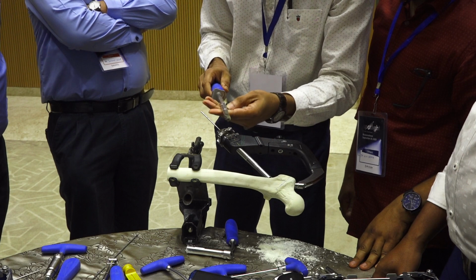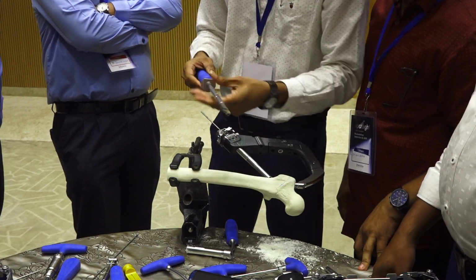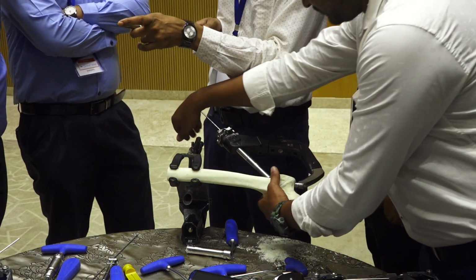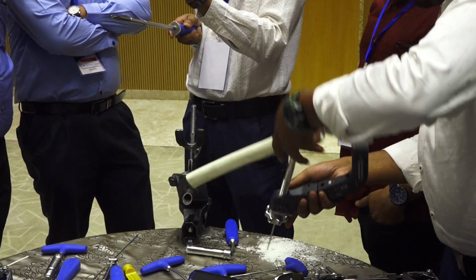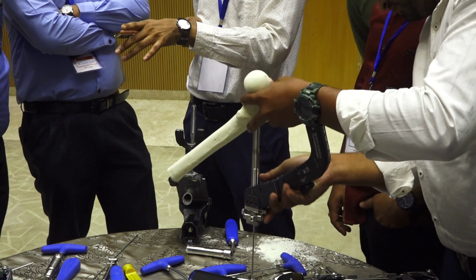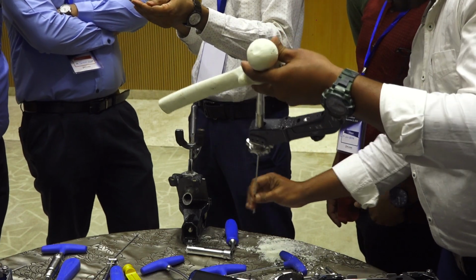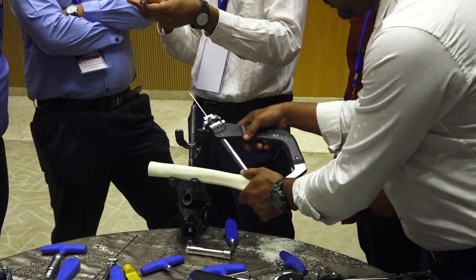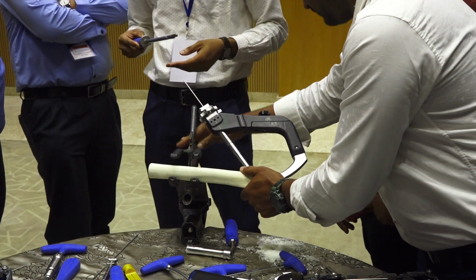Here these are slotted designs with a red mark and a yellow mark. When you hammer this nail, it will rotate like this, and you see this profile. This helical blade profile is different from screws. PFNA2 has a different profile, PFNA also has a different profile. While inserting, it will compact the cancellous bone around it so that it gives better rotational stability, and there is less pullout.